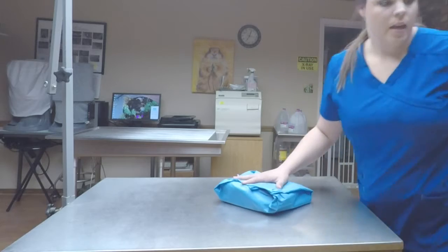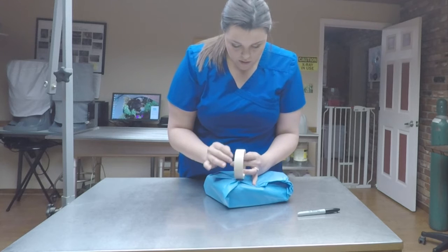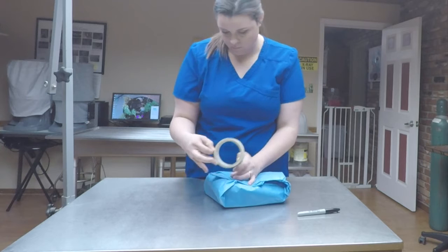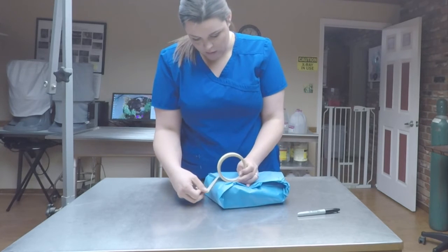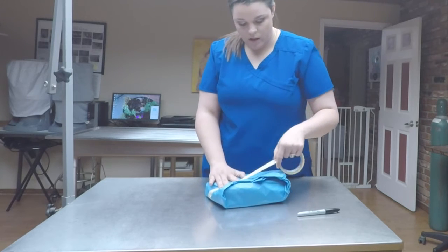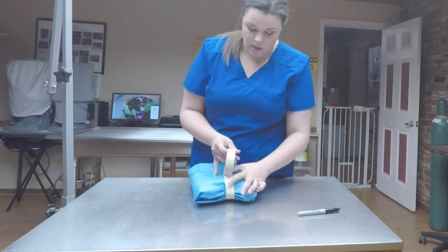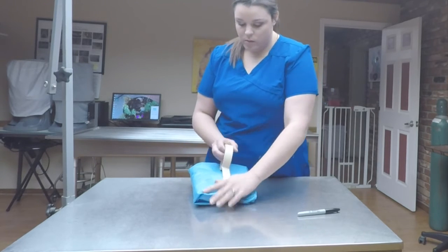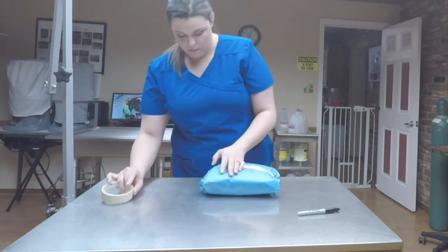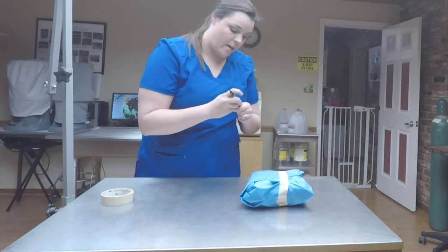And then you will take your indicator tape and wrap it completely. That way when you put it in your autoclave, you will know that you are getting a sterile gown. On the indicator tape, there are lines on here. When it goes through an autoclave, it will turn black once it has been done. Then you will put on here what you have.